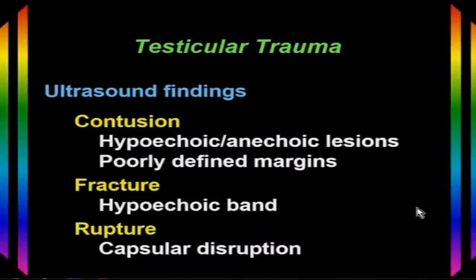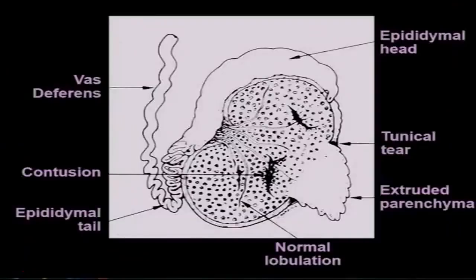Sometimes the testicle itself is involved, so we need to look at it carefully after trauma. With a contusion, we'll have hypoechoic or anechoic lesions with poorly defined margins. With a fracture, there's a hypoechoic band right across the testicle. With rupture, there's disruption of the capsule — a tear in the tunica albuginea with some parenchyma extruded through the gap — and it's common to have an associated hematoma.